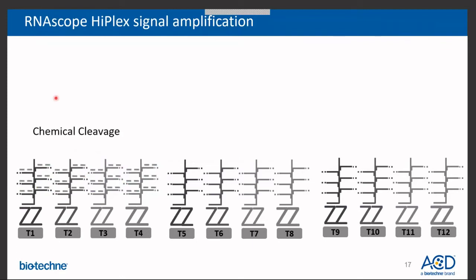After you capture the first round, you gently decover slip and cleave off the fluorophore from the amplification system. The fluorophores then get washed away, but the probes all stay bound, the amp trees stay intact, and in fact, the binding site for these fluorophores is now blocked by the oligo tag that landed the fluorophores on this set of 4 trees in the first place.